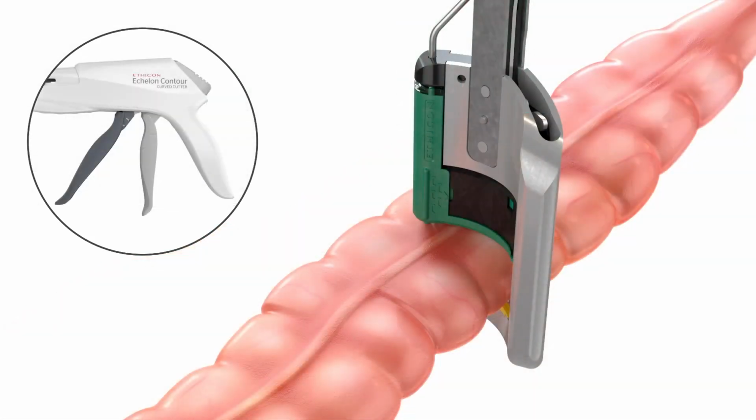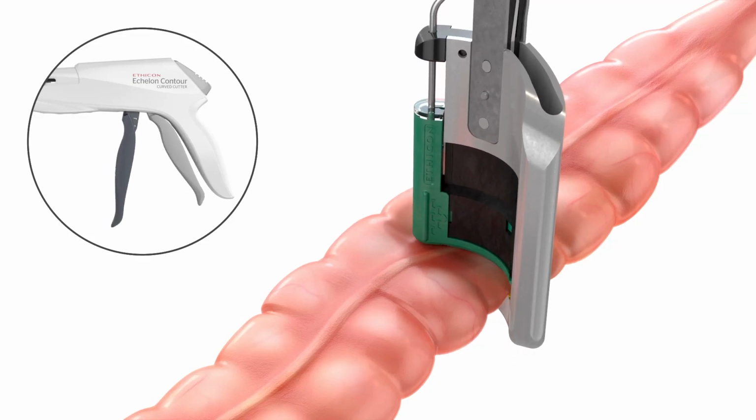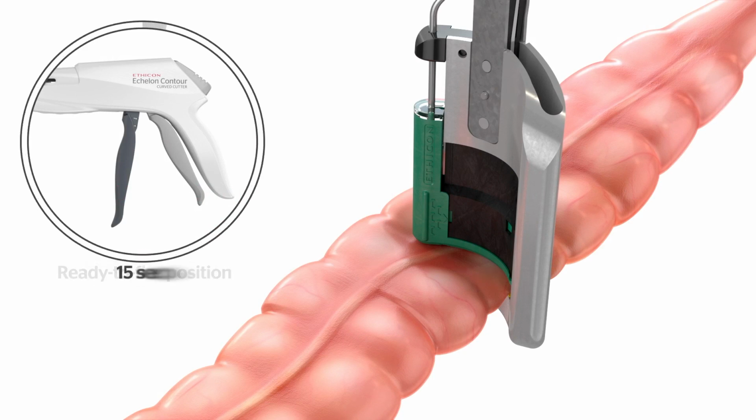Completely squeeze the closure trigger and handle together until the closure trigger is latched with an audible click. If you did not previously advance the pin manually, it will automatically advance and pierce the tissue. When the closure trigger is latched, the firing trigger moves to the ready-to-fire position. Wait 15 seconds to allow for adequate tissue compression.